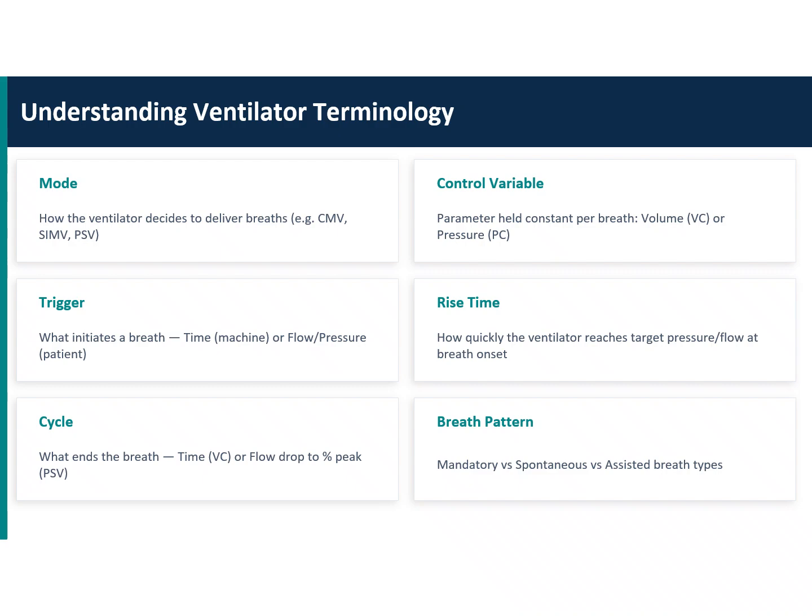So these are the three most common modes of ventilation, and if you master them you will be able to manage any patient. There are a few other modes of ventilation like PRVC, APRV (airway pressure release ventilation), and adaptive support ventilation. If you learn them, it is good, but they are not mandatory. And if you understand VCV and PCV properly, it is not difficult to understand the other modes of ventilation also. So our focus will be very basic. We'll be discussing more about volume control and pressure control.